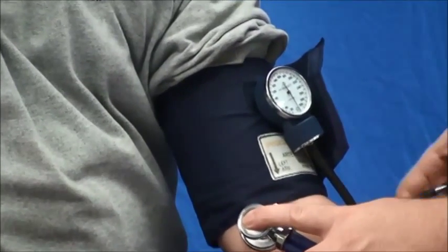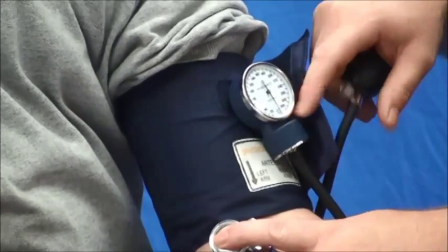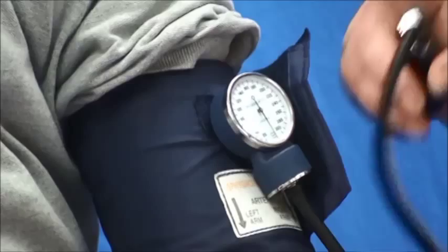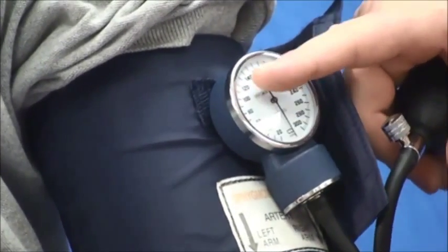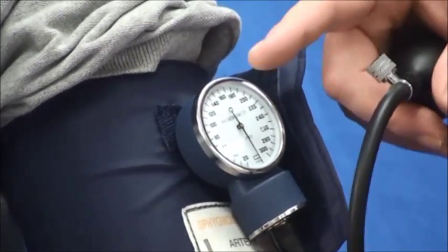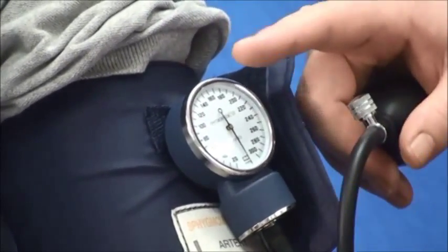You will not hear anything at first. What we want to do is start putting air into the cuff until the point where you can hear the pulse. We'll keep going until the pulse goes away, and then we'll add about 20 to 30 millimeters of mercury beyond the point where we can hear.